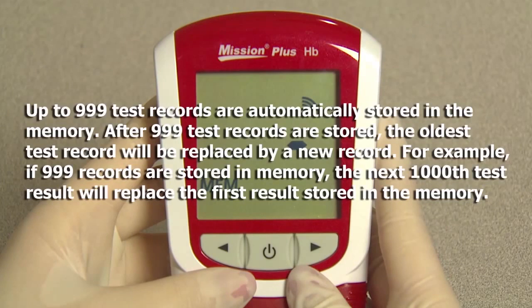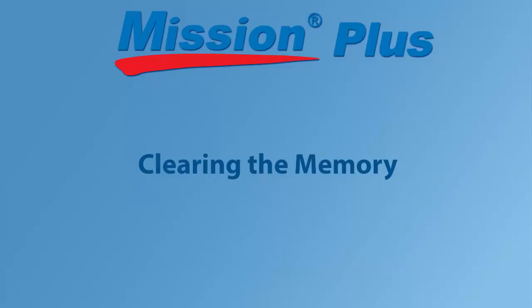Up to 999 test records are automatically stored in the memory. After 999 test records are stored, the oldest test record will be replaced by a new record. For example, if 999 records are stored in memory, the next 1000th test result will replace the first result stored in the memory.